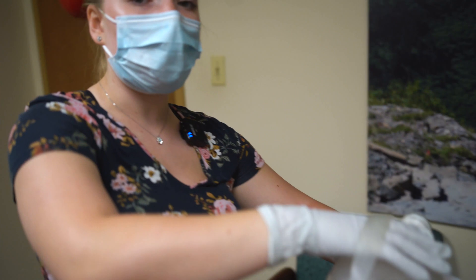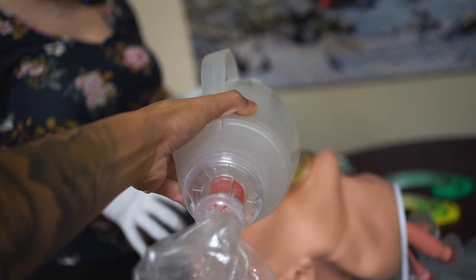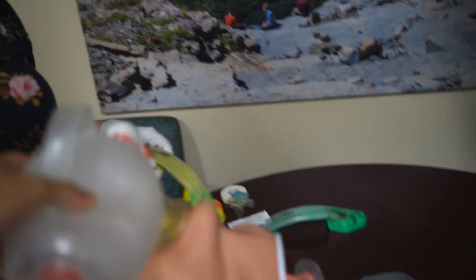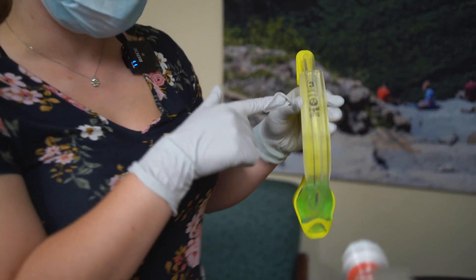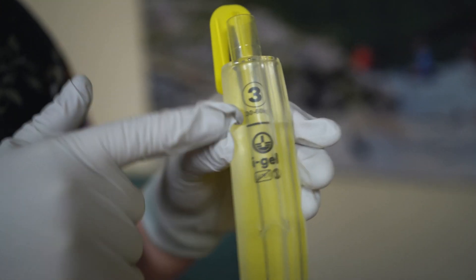At this time I'm going to ask my partner to take over ventilations while I prepare the supraglottic device, the i-gel. My patient weighs roughly 110 pounds — divide by two, that's about 55 kilograms. The i-gel is sized by weight in kilograms, and the size 3 goes for 30 to 60 kilograms, so this is the perfect size.